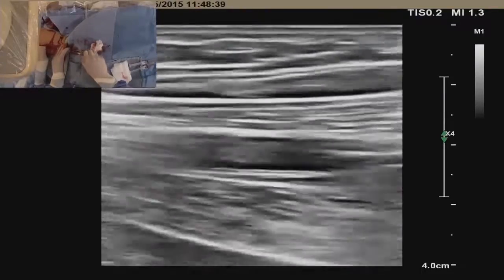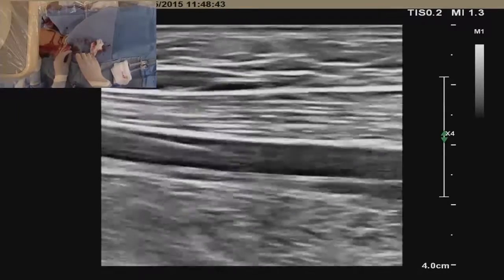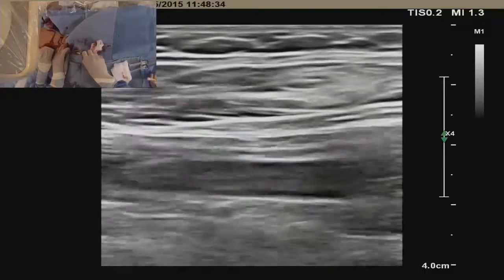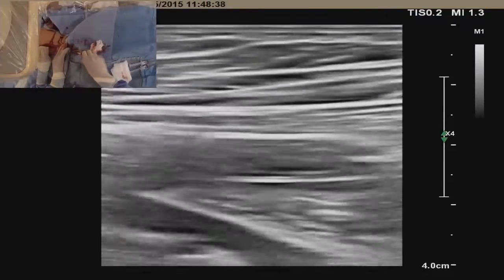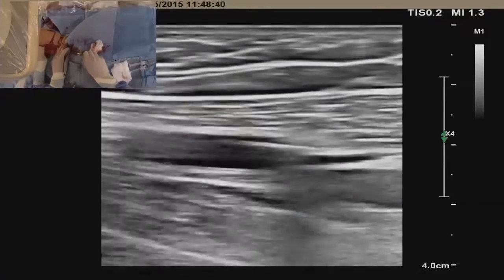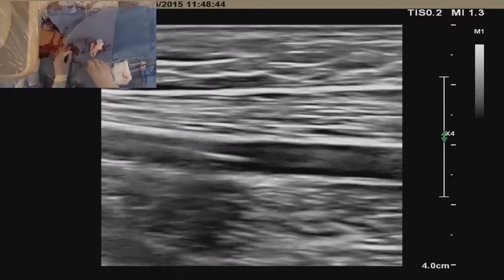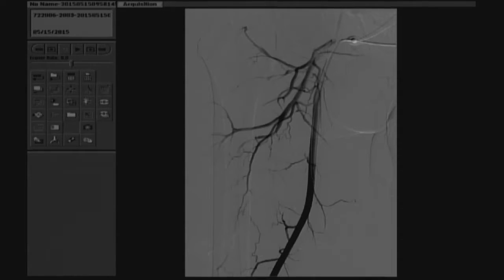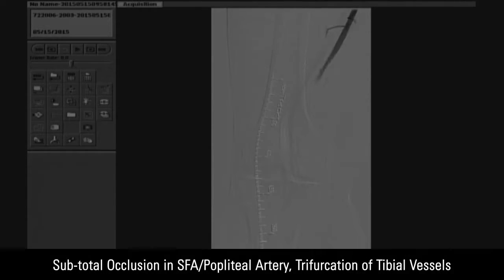Both wires are through a 5 French antegrade access sheath — in this case, we're using a 2-lumen 5 French Precision sheath. Once we redirect the wire into the SFA, we can advance the 5 French sheath over the 0.018 V18 wire. These are the diagnostic images, and what you see here is the blood flow in the SFA and the popliteal artery, and then the subtotal occlusion in the SFA-popliteal artery.